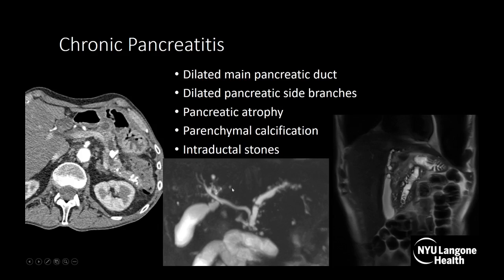Here's another case on coronal MRCP — a heavily T2-weighted sequence. You can see a dilated main pancreatic duct with dilated side branches. There's a crisscross configuration here: the main pancreatic duct going to the minor papilla, and the common bile duct draining to the ampulla. This is an example of pancreas divisum, which is one of the causes of chronic pancreatitis.